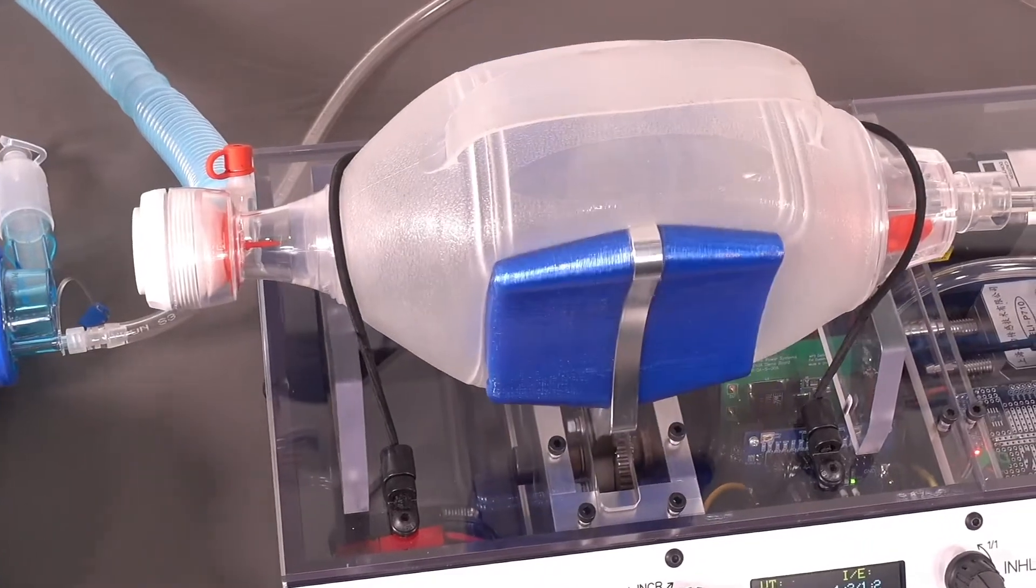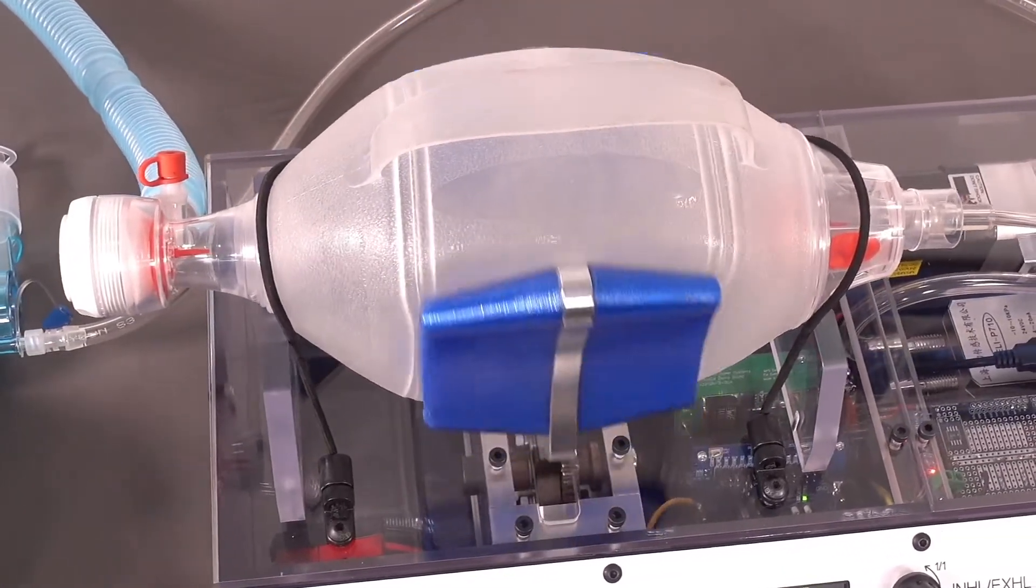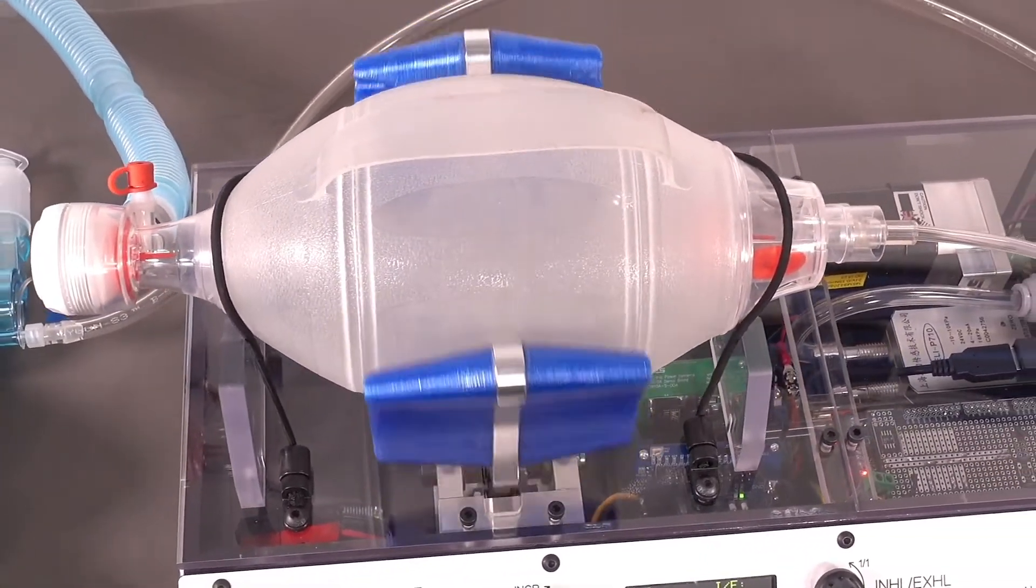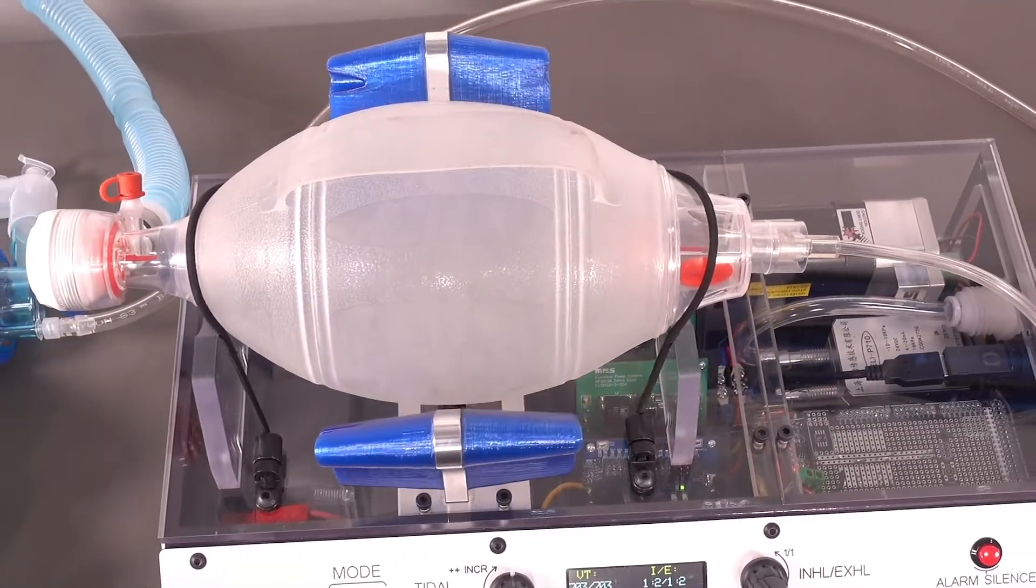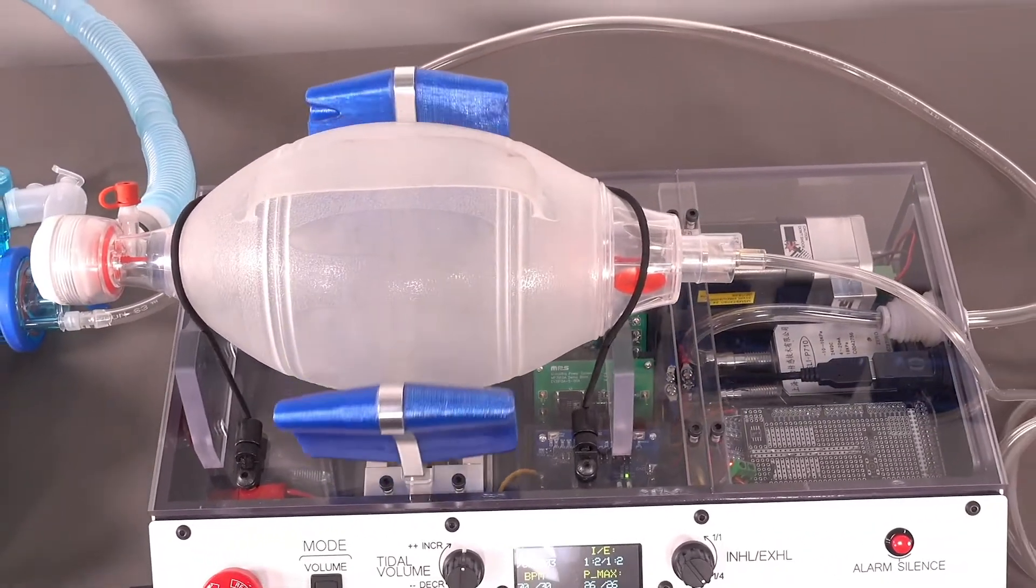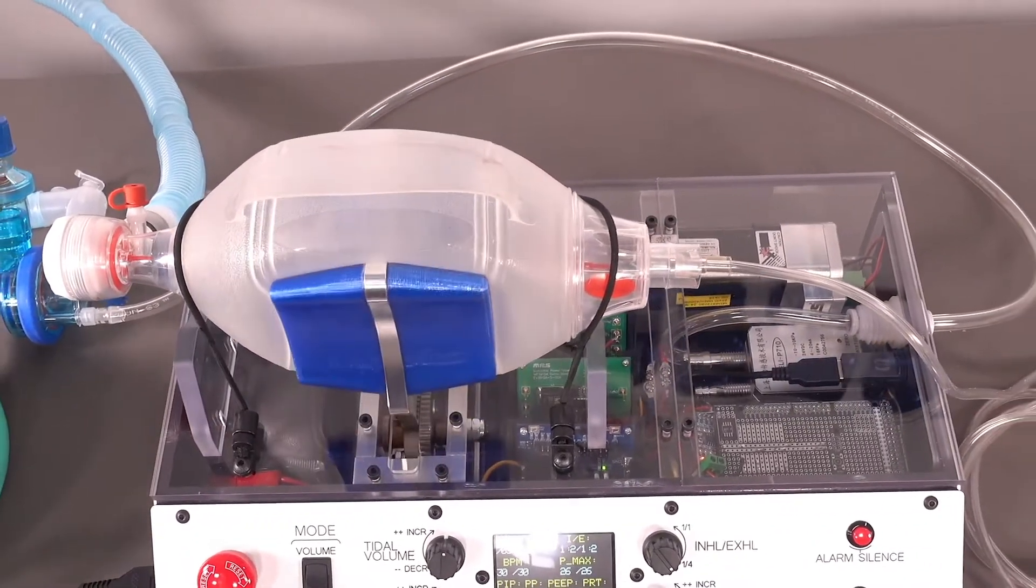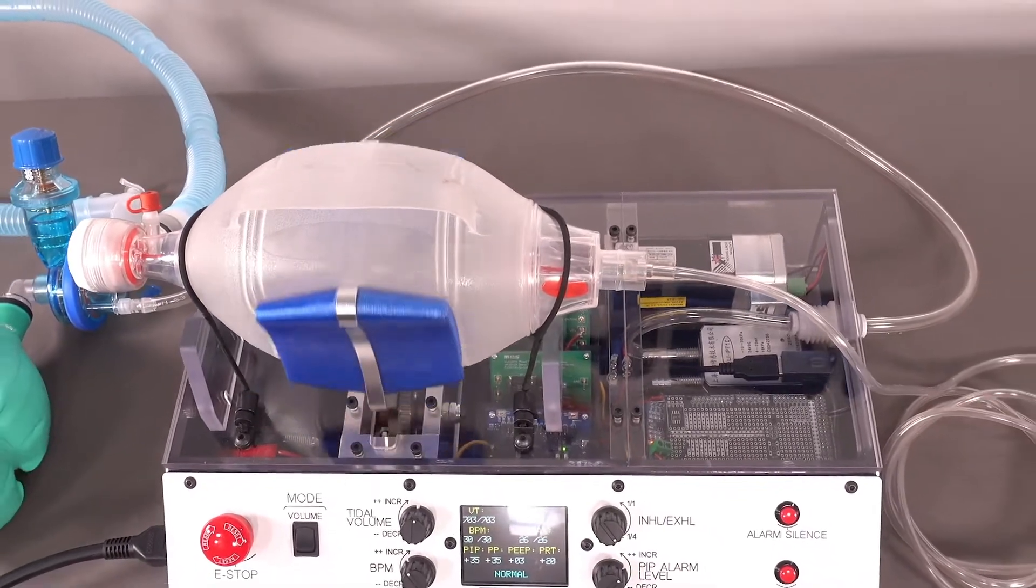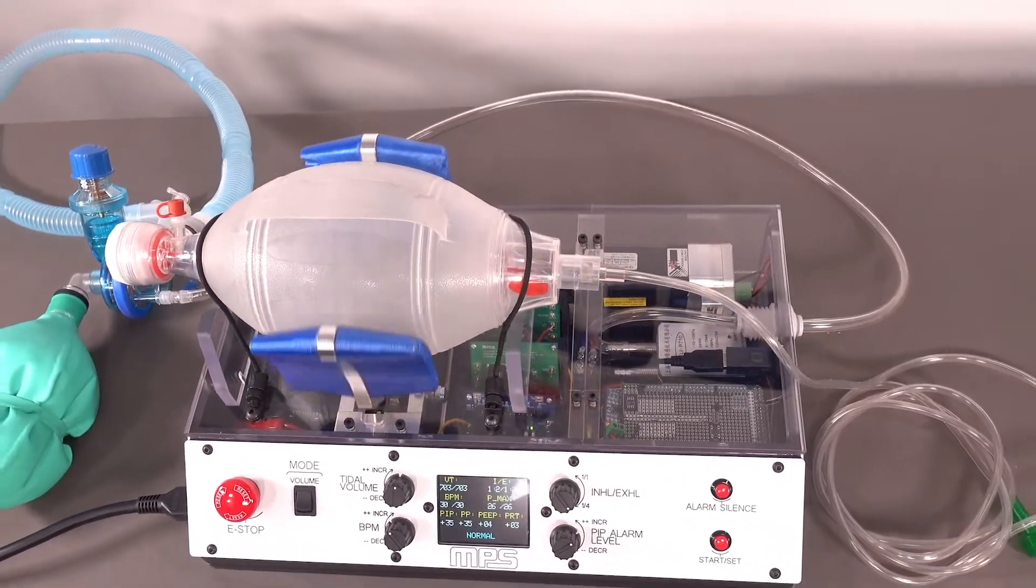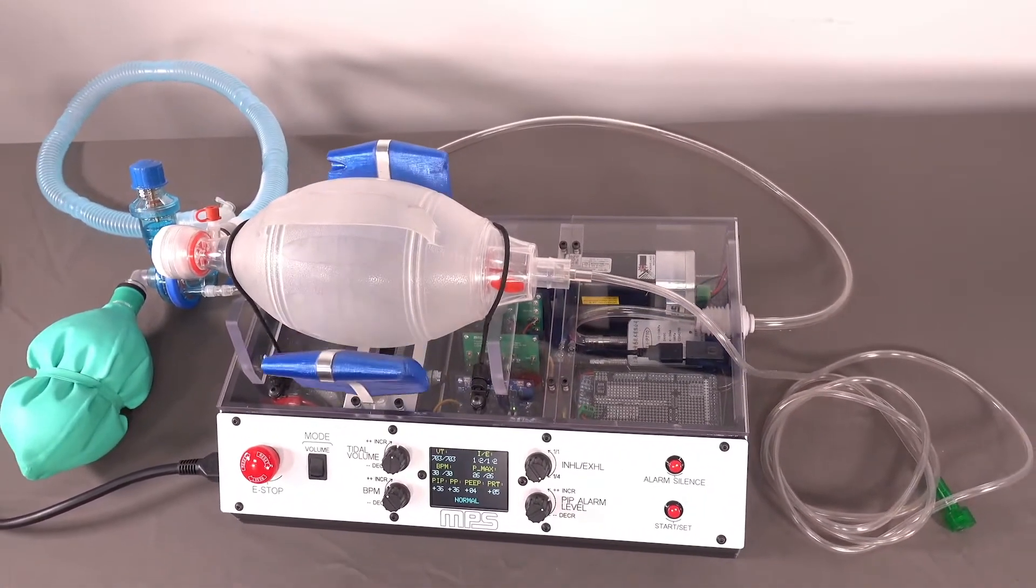The system automates the squeezing of a bag valve mask, or BVM, which is usually manually operated by a trained medical professional in temporary emergency situations. By automating this activity, patients can receive extended assistance and medical personnel can be freed up to assist additional patients.